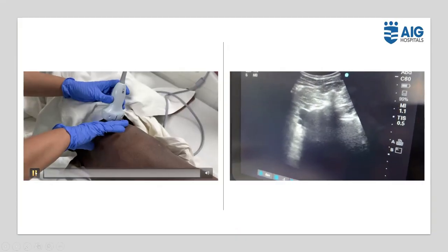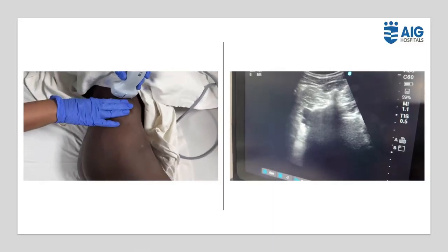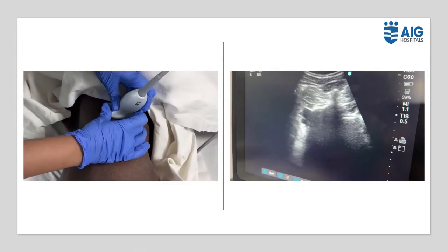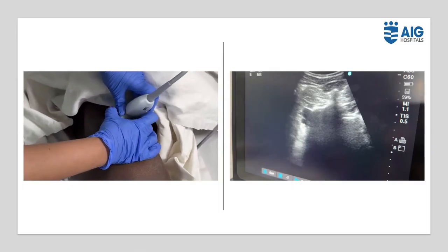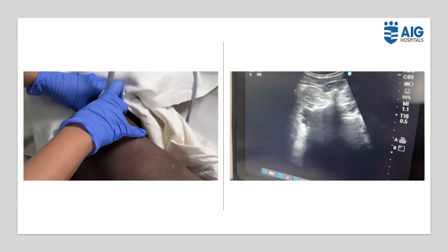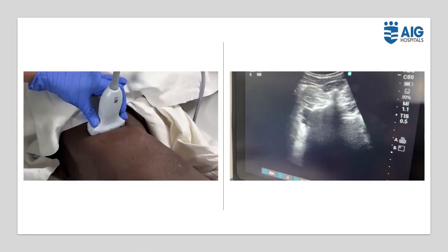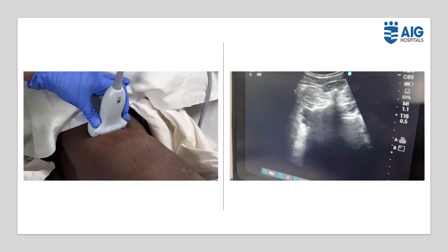A line is then drawn on the patient's back, extending from the center of the transducer to the midline of the back. A nerve block needle is inserted 4 cm from the midline along this line and gradually advanced anteriorly until the needle tip is close to the L3 nerve root. After confirming with nerve stimulation, the 20 to 30 ml of local anesthetic is injected slowly in aliquots.